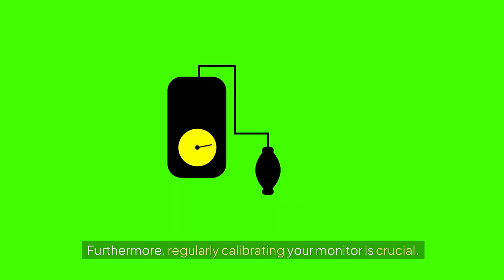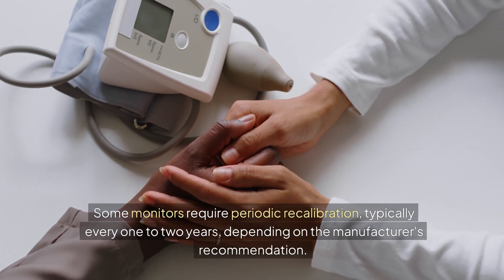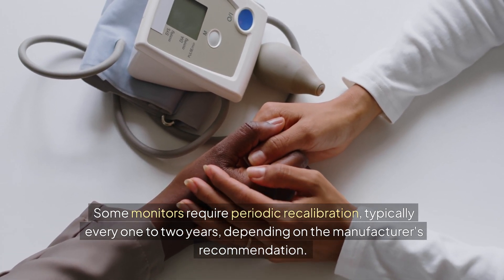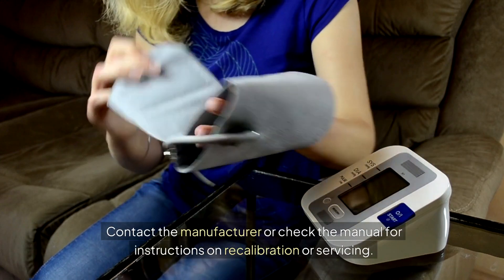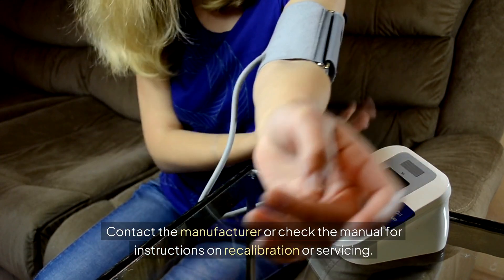Furthermore, regularly calibrating your monitor is crucial. Some monitors require periodic recalibration, typically every one to two years, depending on the manufacturer's recommendation. This ensures that the internal mechanisms are functioning properly. Contact the manufacturer or check the manual for instructions on recalibration or servicing.